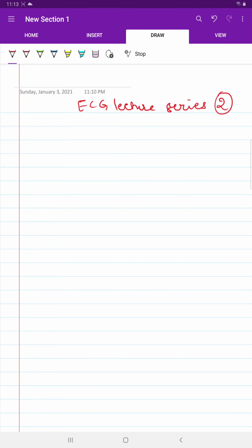In this lecture, I will discuss the 12 lead ECG and its relationship to the heart. I hope you have seen my first lecture. In that, I explained the P wave, Q wave, R wave, their normal values, and their normal duration. If we know the normal duration, at least we are very sure that this reading is normal and that reading is abnormal. So coming to today's lecture, 12 lead ECG.